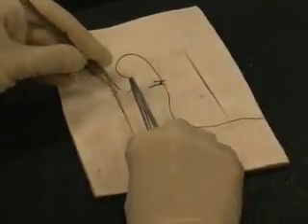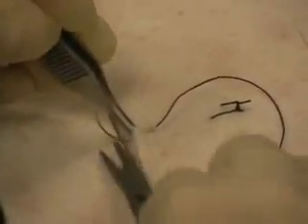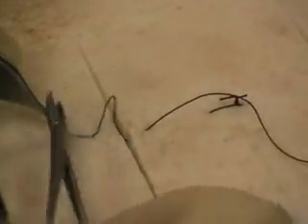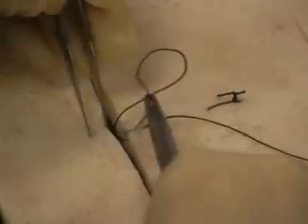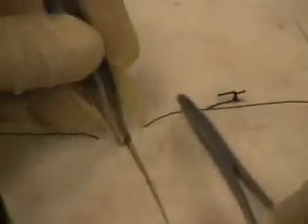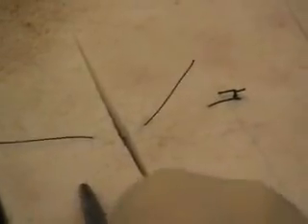Holding our forcep correctly, we're going to go ahead and open up the wound edge so we can see where we're coming through, and we are going to go ahead and reload halfway through here, so we'll just pull a little bit and reload right there. Always be conscious of where your fingers are. I've seen a lot of students hold like this and they're forcing through, and if you watch, their needle could end up poking themselves right in the finger. So stay out of your own way. Use the forceps to help you, but make sure you know where your fingers are. We're going to go ahead and pull this through just like before.